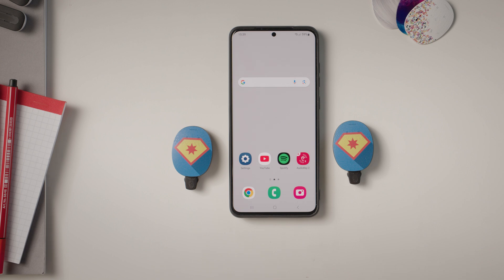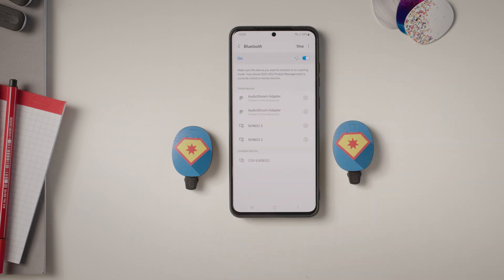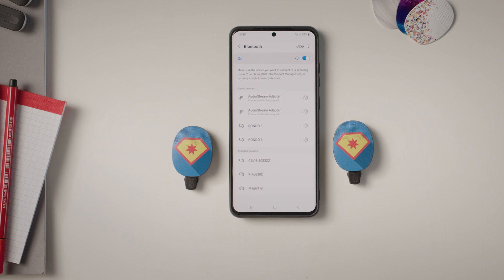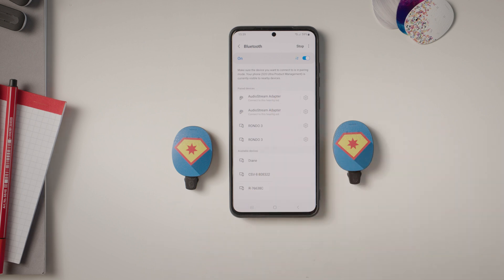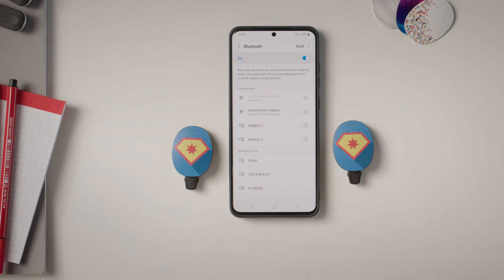Follow the instructions provided by your phone's manufacturer to connect to a Bluetooth device. Connect to the AudioStream adapter. Your AudioStream adapter will connect automatically whenever it is switched on and your phone has Bluetooth enabled.